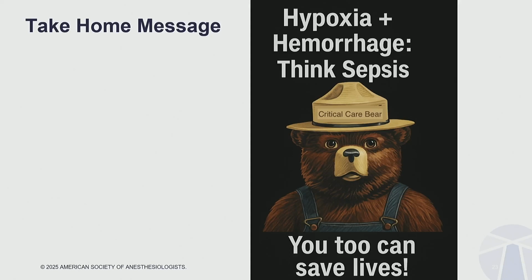Yes, thank you for your comment. I agree, of course, the diastology is nothing to diagnose for a patient during the general anesthesia. And I also want to emphasize that, of course, diastology is not part really of performing a focused cardiac ultrasound. What I still wanted to share this slide because there were new recommendations on diastology just coming out in July.